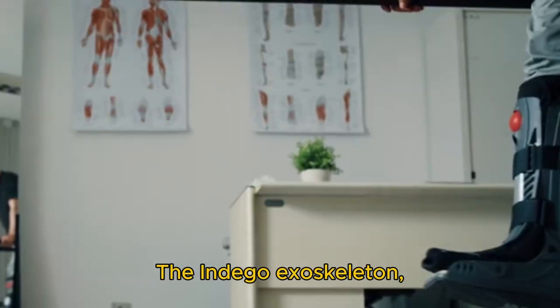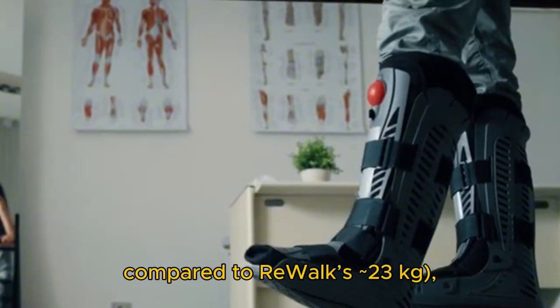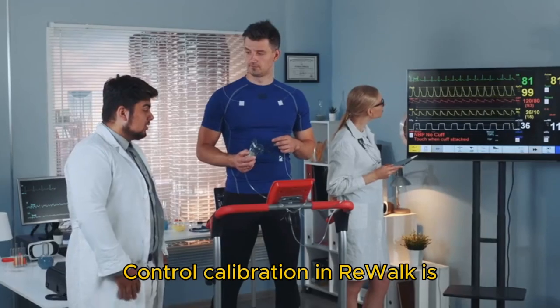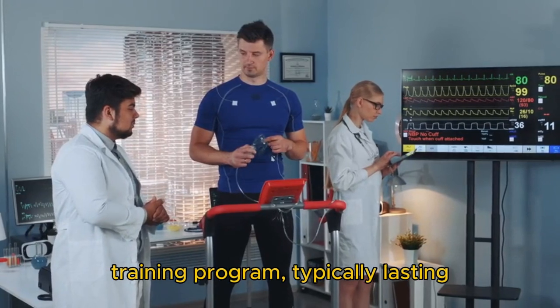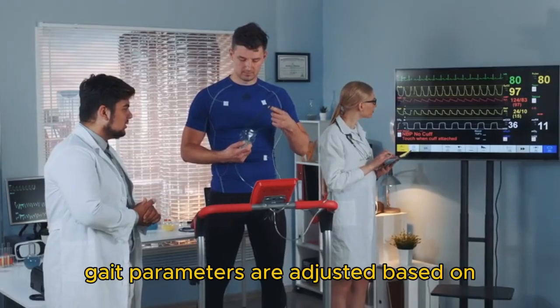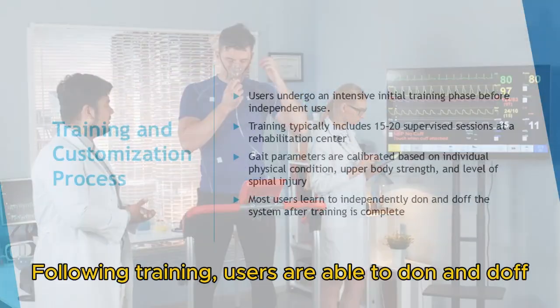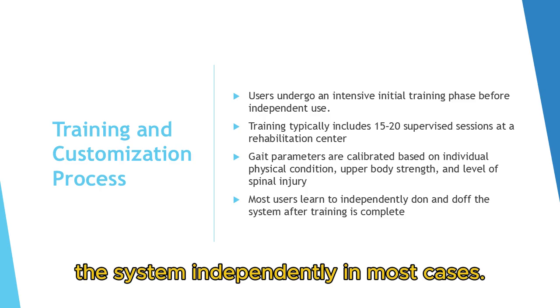The Indigo exoskeleton, while modular and lighter at 12 kg compared to ReWalk's 23 kg, is limited by a more fragmented user base and narrower community deployment data. Control calibration in ReWalk is individualized through an initial clinical training program, typically lasting 15 to 20 sessions, where gait parameters are adjusted based on user capability, injury level, and upper body strength. Following training, users are able to don and doff the system independently in most cases.